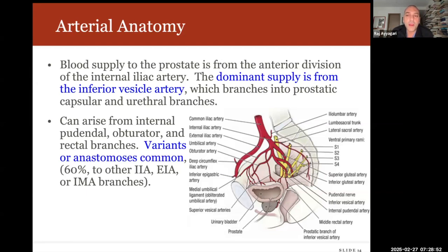However, with men with enlarged prostates, these are elderly men that will perhaps have more atherosclerotic disease. The vessels feeding the prostate, even when they're very big, are generally pretty small. And like I said, for glands that are on the small end of the scale, they'll commonly have small arteries, and so they can be challenging to find and then to get into with a microcatheter. Lots of variations in the anatomy are also present, and I would say almost the norm.